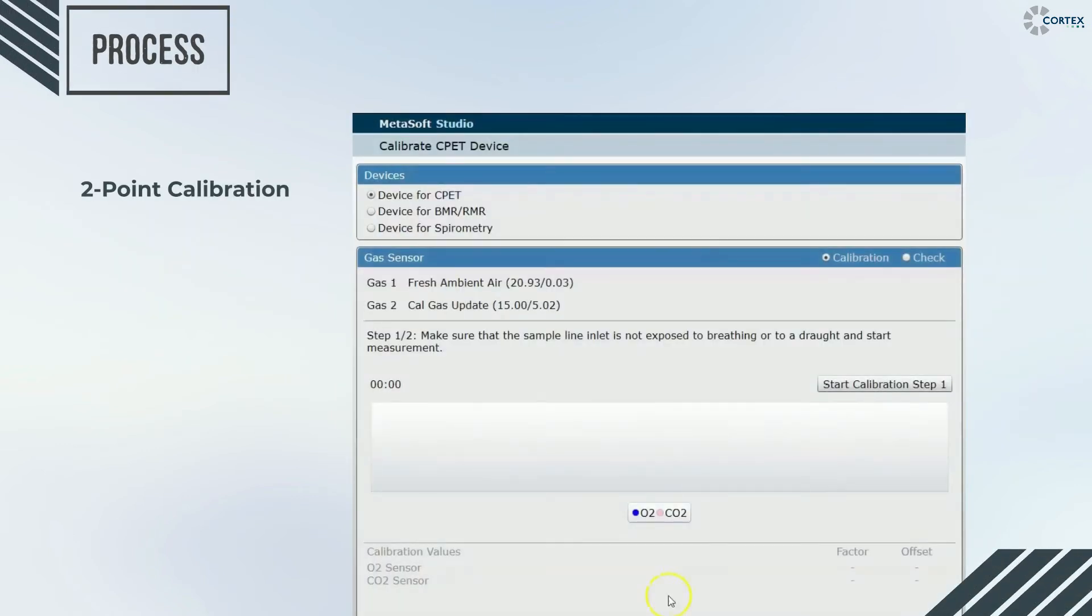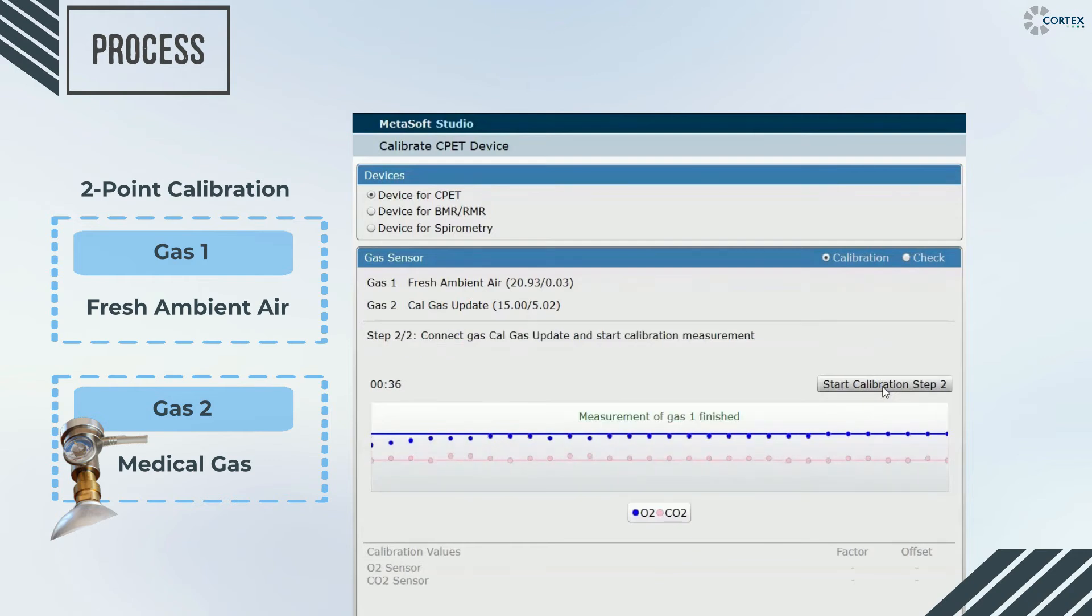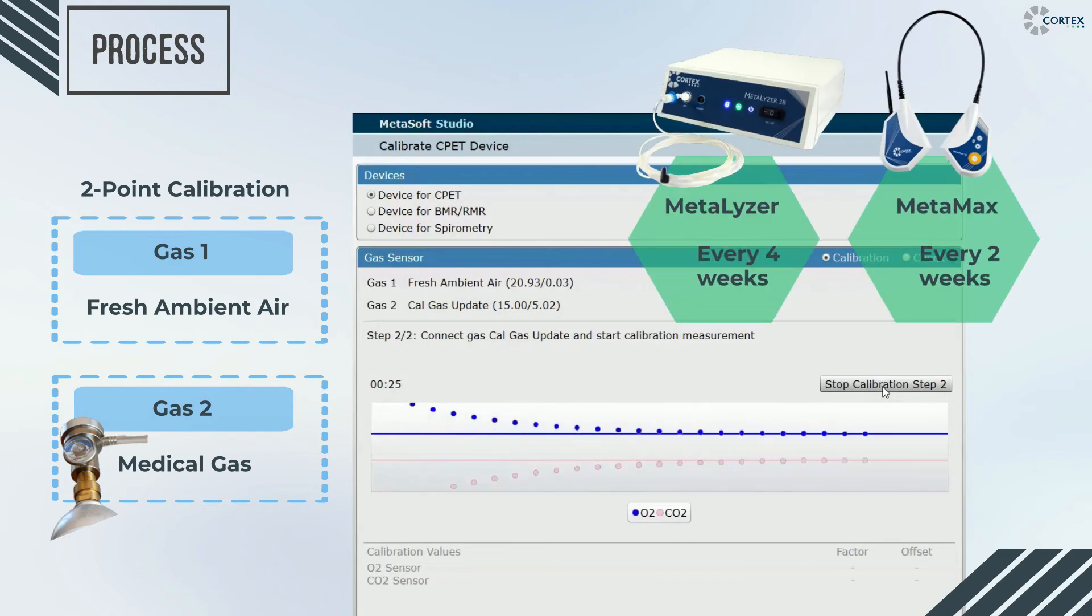The two-point calibration consists of two steps: sampling of the ambient air and sampling of the medical gas. By reading these two values, we check for any potential drifts of the sensor. As depicted on the clip, the intervals of a two-point calibration are performed every two or four weeks for each respective device.